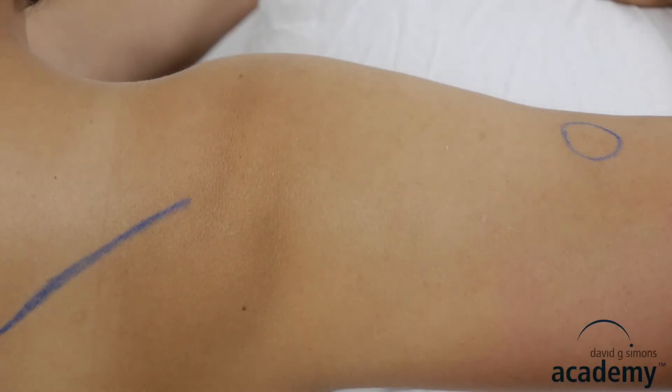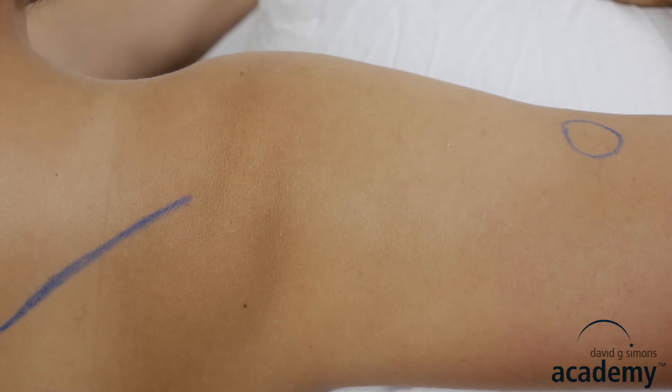The thickness of this muscle varies a lot. Therefore the length of the needle is between 3 and 5 cm, depending on the thickness of the muscle and the location of the trigger points.